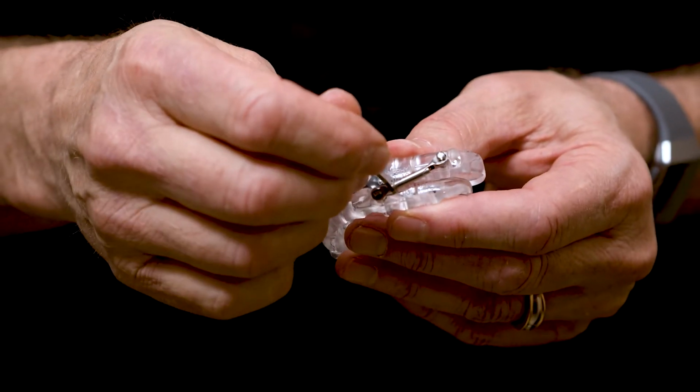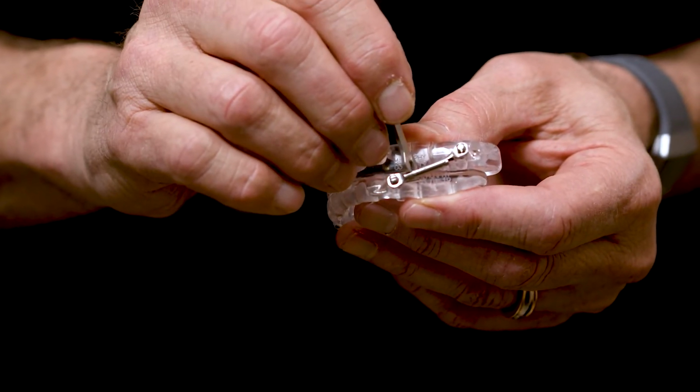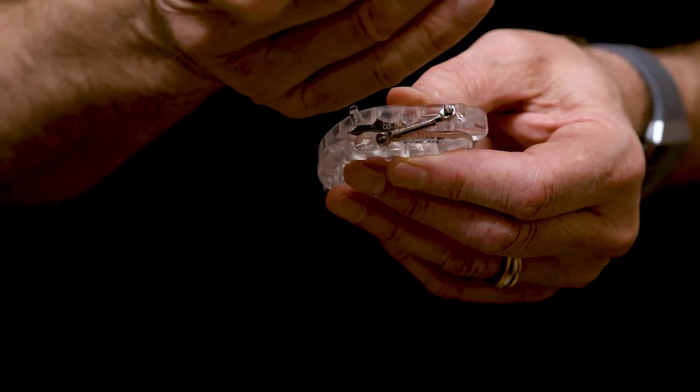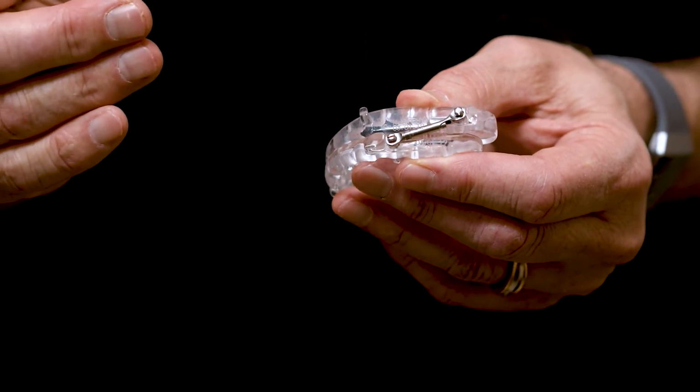And the same sort of thing, turning in the direction of the arrow, each quarter turn is going to give you 1/10 of a millimeter advancement. You can also go against the arrow, and that would be retruding the mandible that same amount per quarter turn, 1/10 of a millimeter. Now the reason that we have two different kinds of continuous advancements or micro-titration devices is of course because the Herbst is a PDAC approved device. So you could use this with your Medicare patients.